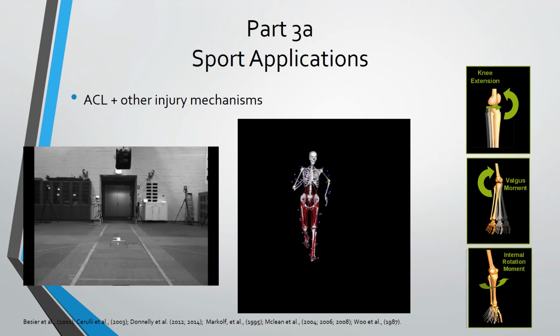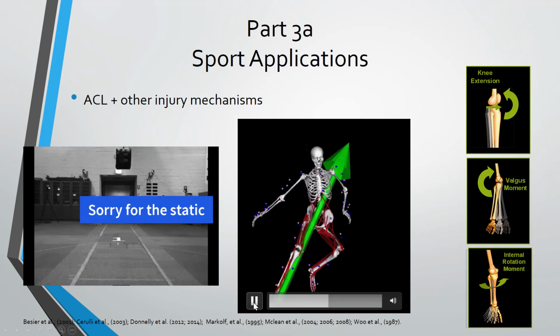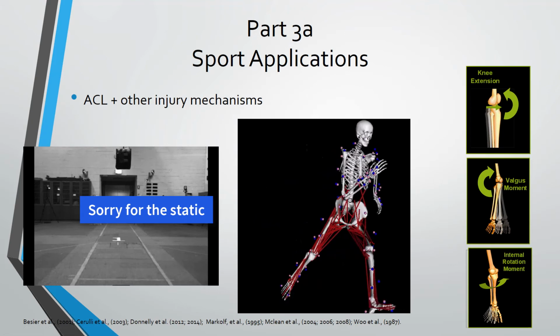After an intervention, we can reassess them, retest, and see and quantify any improvement to their kinematics and joint moments. If they have improved, we might be able to move them from the at-risk category. The research in this area is still ongoing. At the moment, they're looking at, in particular, long-term interventions and prevention strategies.